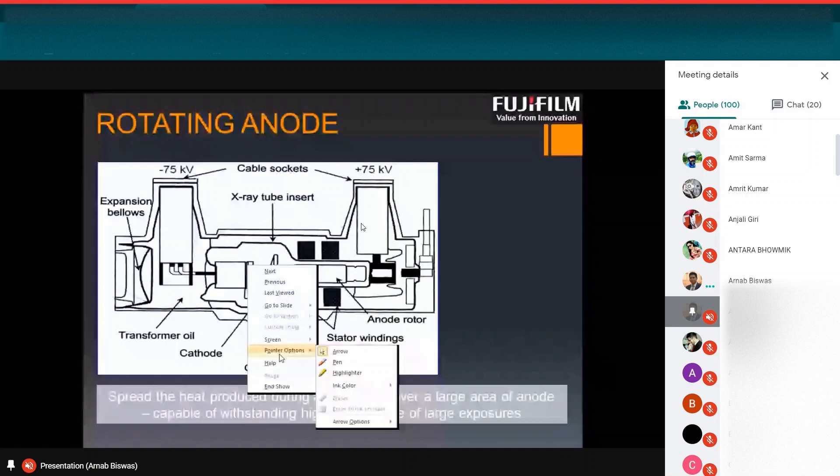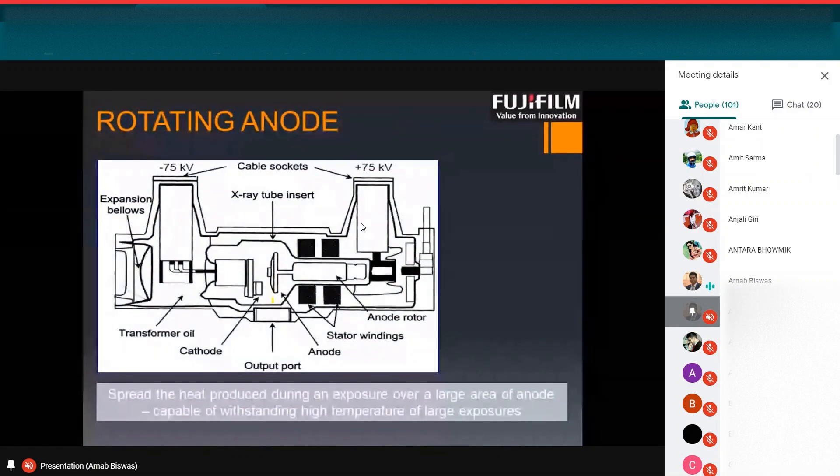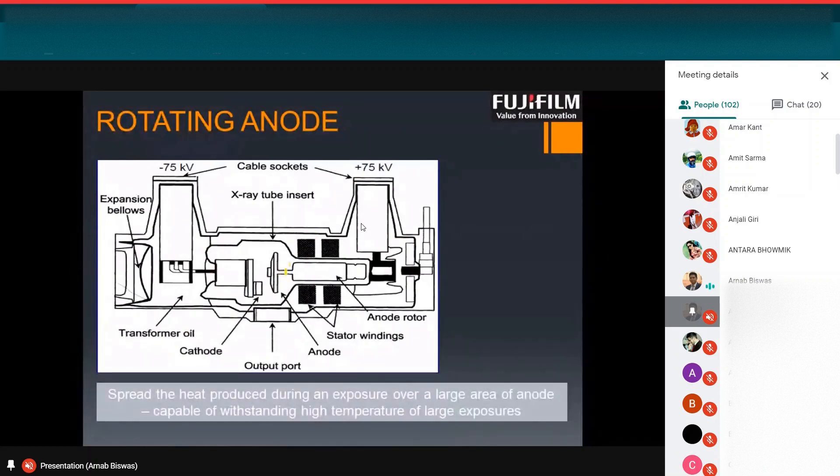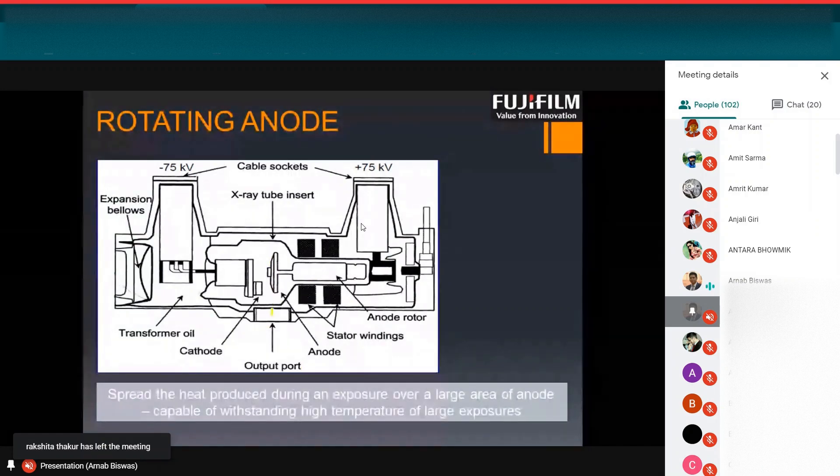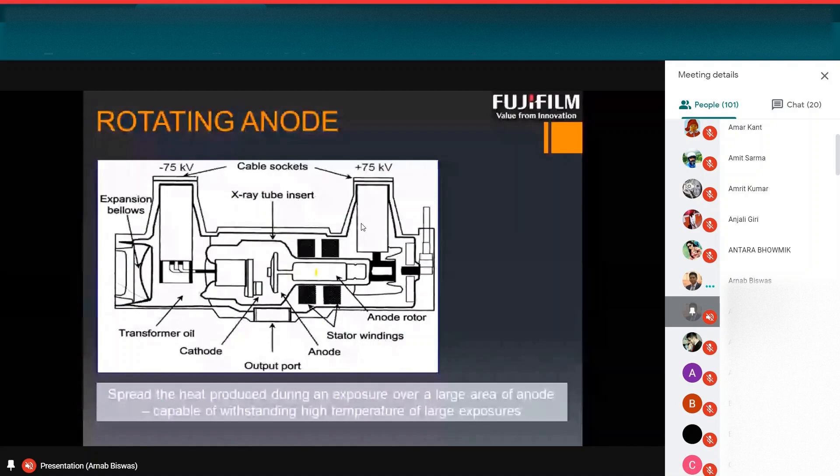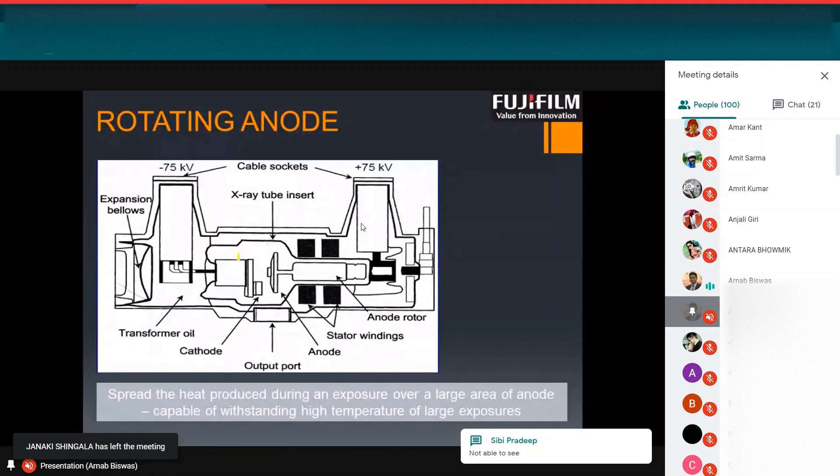Here you can see, this is the anode target and this is the cathode end, where these things have been placed inside an evacuated glass. This anode is connected with an anode rotor, which is the induction motor to rotate the anode. This is the output port. Here transformer oil is used as a coolant because enormous heat is generated inside this tube. And in both sides, a high voltage electric source is connected in both sides of cathode and anode.